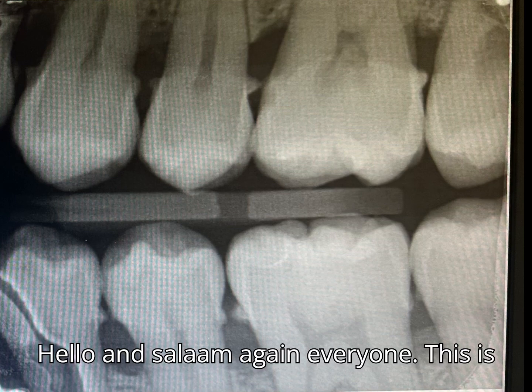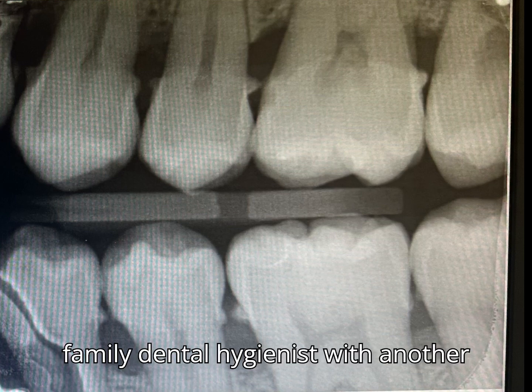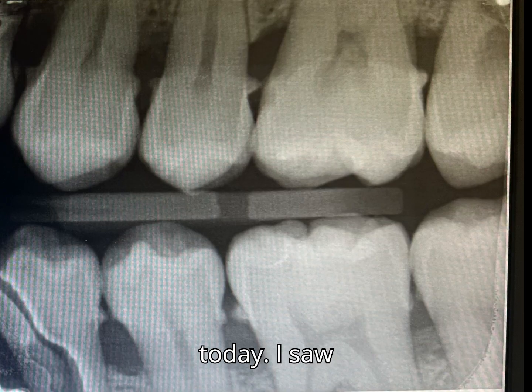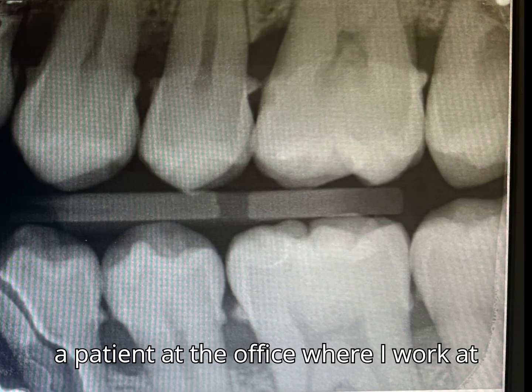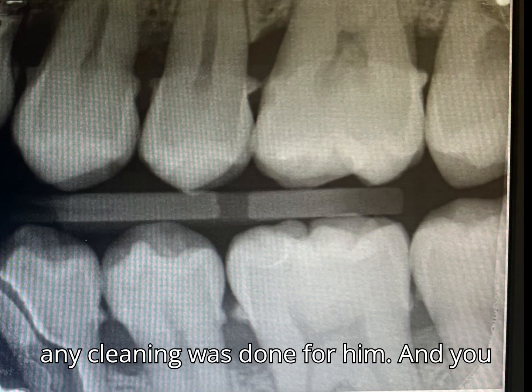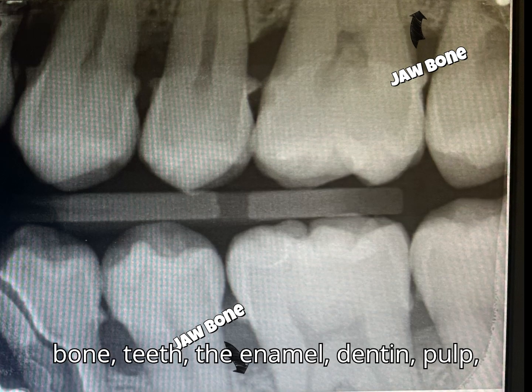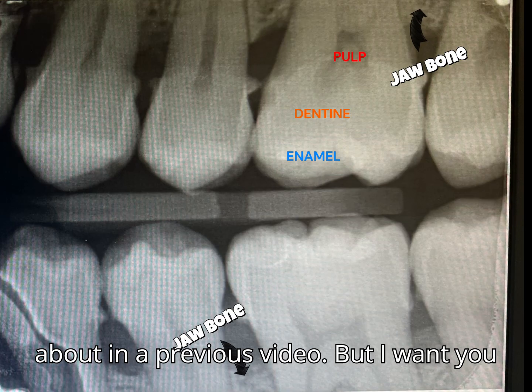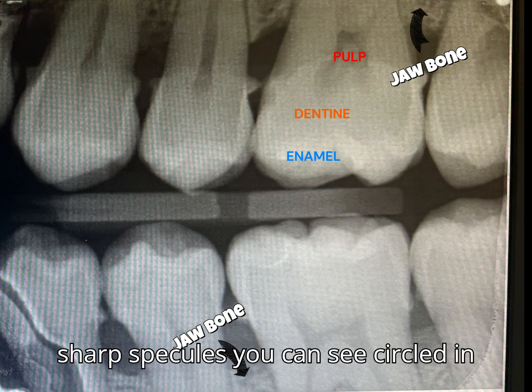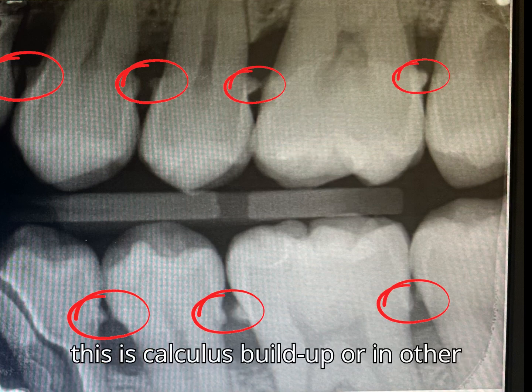Hello and salaam again everyone, this is Family Dental Hygienist with another quick video. I have a really fun case to share with you today. I saw a patient at the office where I work as the dental hygienist, and this is an x-ray I took for the patient before any cleaning was done. You can see a lot of normal structures like bone, teeth, the enamel, dentine, and pulp — the three layers of teeth we talked about in a previous video — but I want you to pay attention to these sharp spicules circled in red. This is calculus buildup, or in other words, tartar buildup, as a result of neglectful dental hygiene.